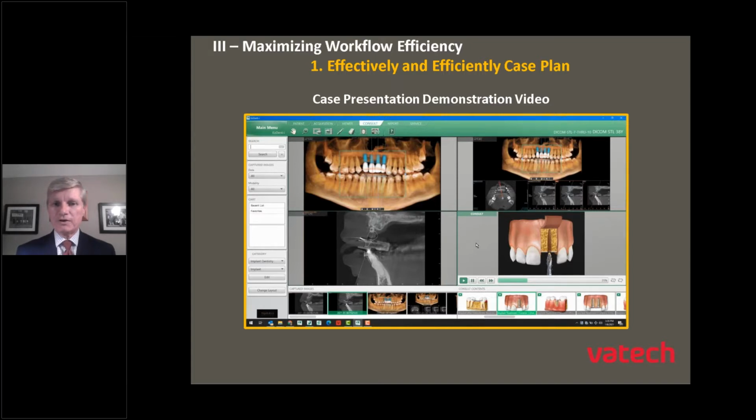Okay, this is where having the conversation with the patient before even getting to this point, say, hey, you know what, here are the images I've got. You know, how much detail do you want me to go into in terms of explaining what is incorporated as part of doing this type of treatment? Look at just the images, that's fine. If they want to be further educated, like I'd want to be, and be able to see these education type videos, certainly I want to know what's involved to understand fully part of this type of treatment plan.